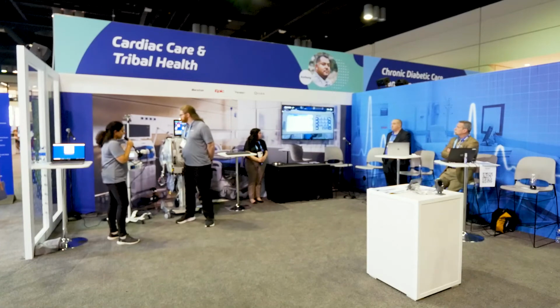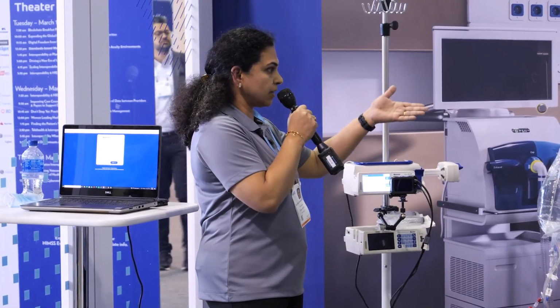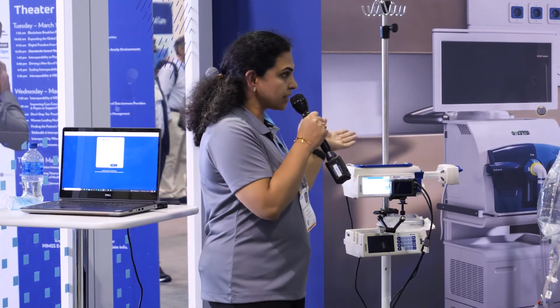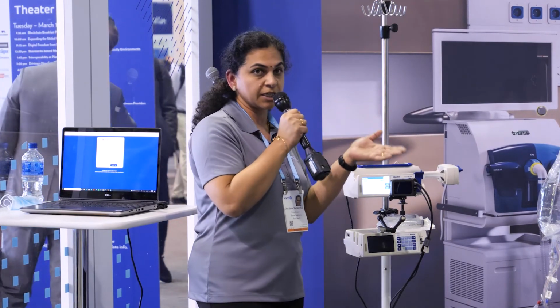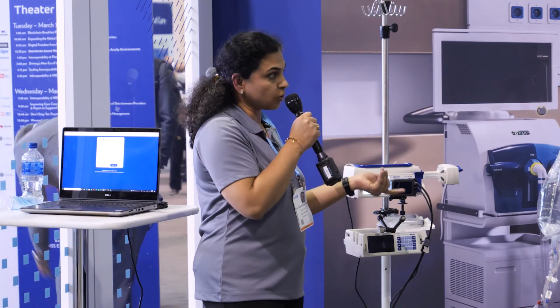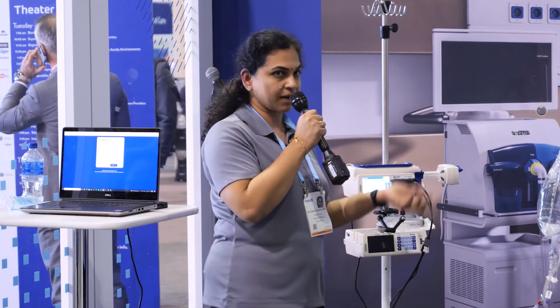So here we are seeing the scanning of the pump, the patient, and the syringe, which proves the 5 rights of medication administration, which is right patient, right pump, right dose, right medication, right time, and right route.